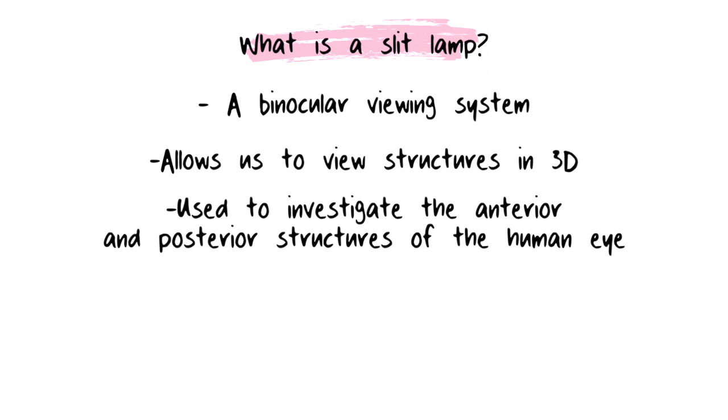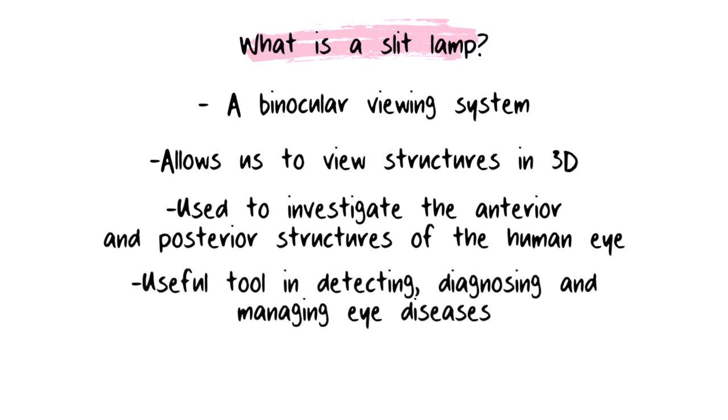In order to examine the eye clearly, a slit beam of bright light is focused onto the eye and viewed under a microscope. This gives the examiner a closer look at the different structures that make up the eye. It is a very useful tool in detecting, diagnosing, and managing eye diseases.